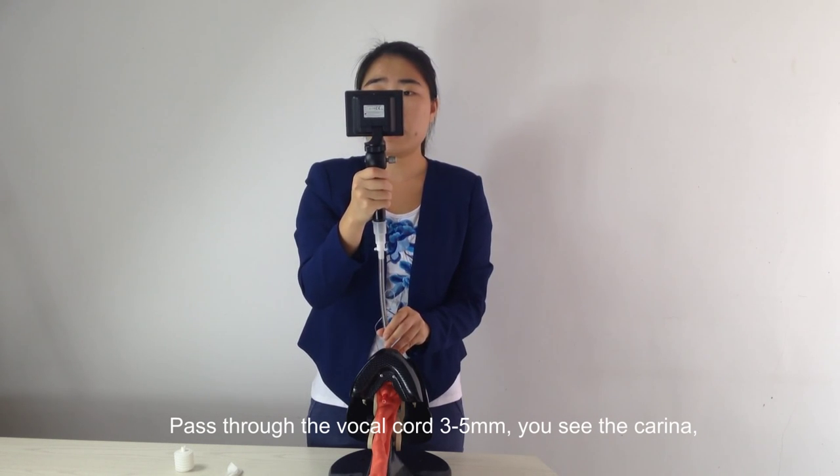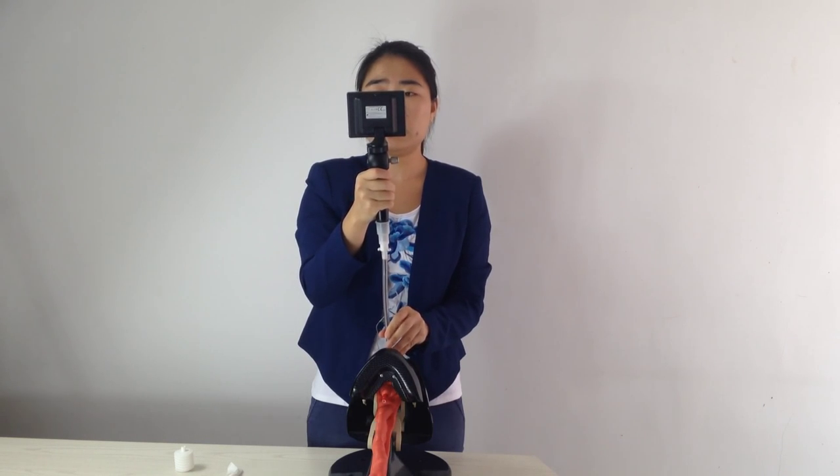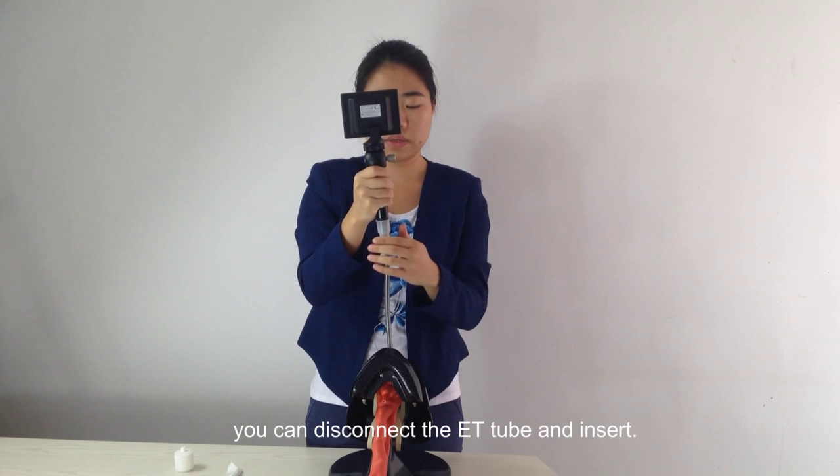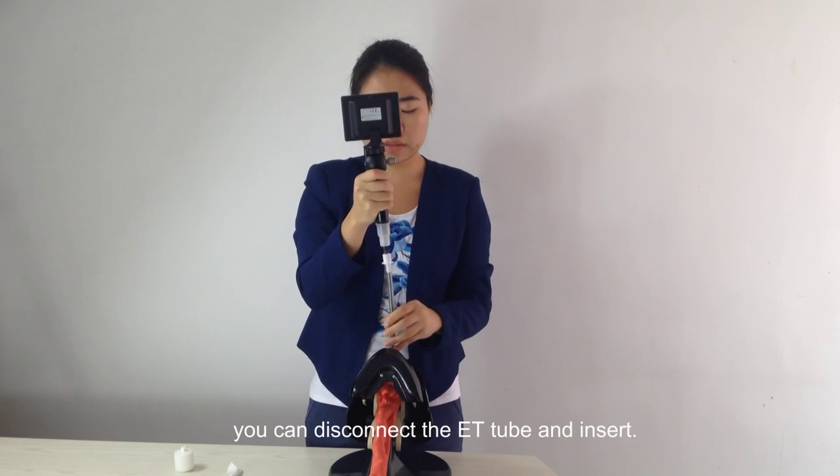As you pass the vocal cords 3 to 5 cm, you will see more clearly. You can then disconnect the ET tube from the scope and advance it into position.